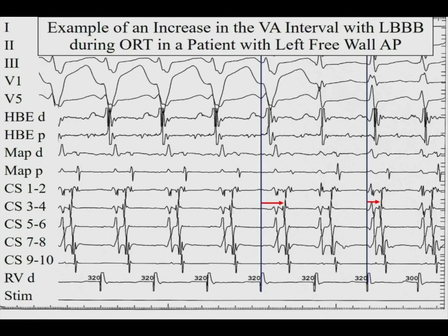So this is a signal, a signal, a signal, and a signal here. You have to sort out what's the A, what's the His, and what's the V. Part of this is when you're moving the catheter in the EP lab, you can sort that out. But you often have the luxury of looking at other electrograms on your catheter. But this, with a narrow QRS, is the expected time to record a His. It's a discrete electrogram. It's consistent with a His. But there is some noise in there. So I think that's what the A and the His and the V are, but it's not a great example. This is particularly a challenge with catheter instability during tachycardia.